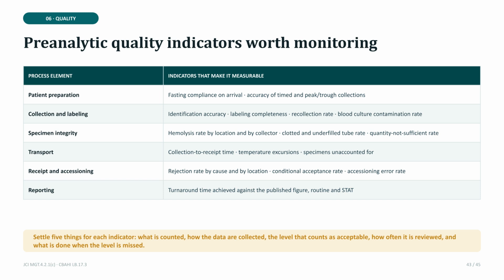Maintaining identity after receipt is crucial. Whether you are aliquoting, staining, or archiving, every transfer point is a potential for error. Every secondary container must be traceable back to the primary specimen, and ultimately, to the specific patient.